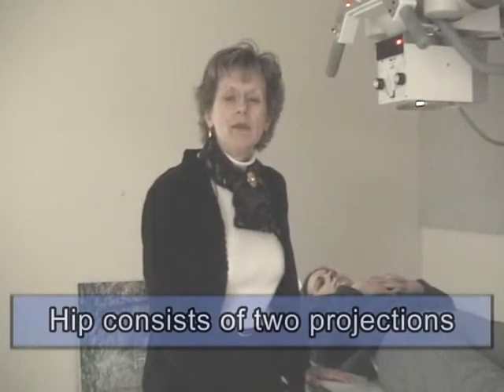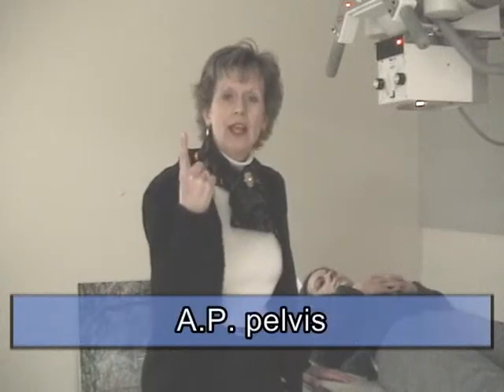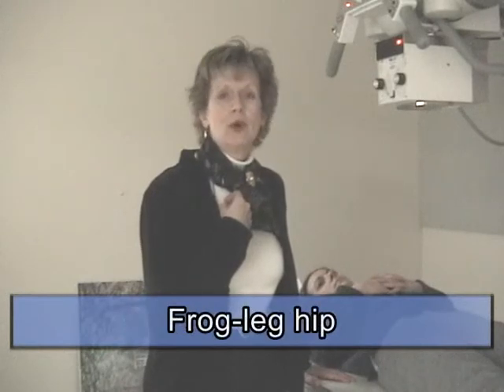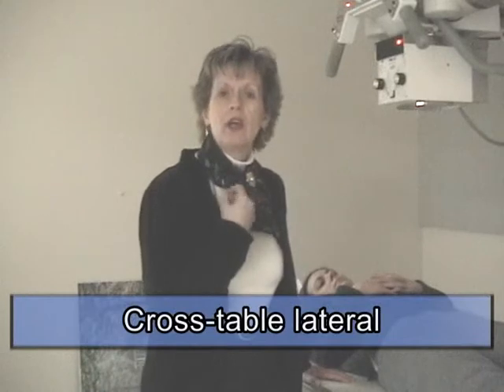So a hip consists of what? Two projections, AP pelvis, and then a choice of the lateral. What were your choices of the lateral? A frog leg hip or a cross-table lateral hip. So let's start the demonstration of the AP pelvis first.